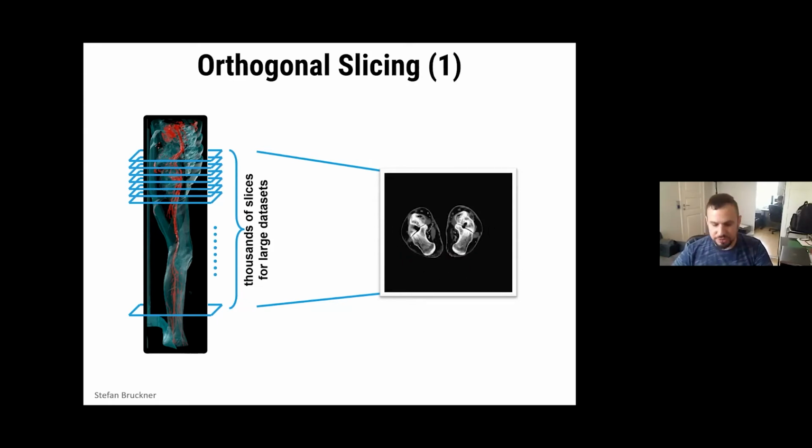This is, for instance, done for diagnosing pathologies such as calcification in blood vessels that may ultimately lead to complete occlusions of these vessels, which is obviously not something that is desirable.